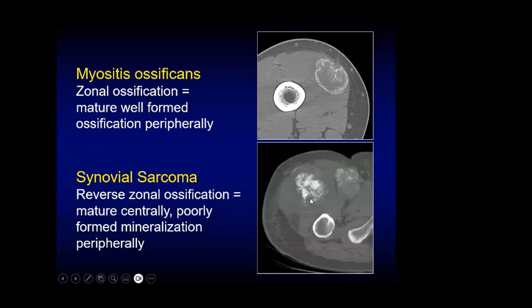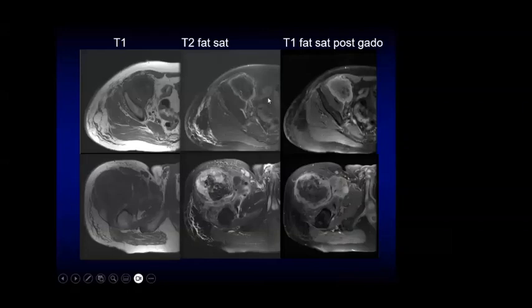And you need to remember that with synovial sarcoma, it is always helpful to either have an X-ray or CT, because MRI scan is going to miss the calcification. We can't really see the calcification on MRI scan. But this is one of the weaknesses of MRI scan.